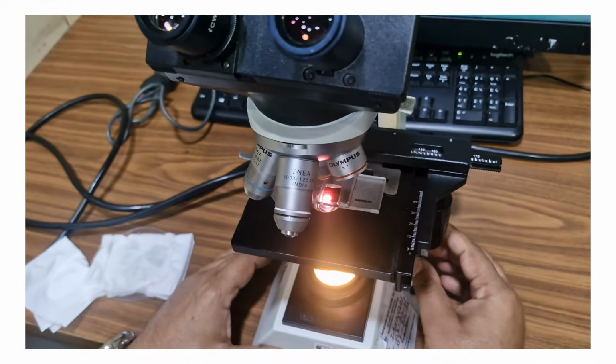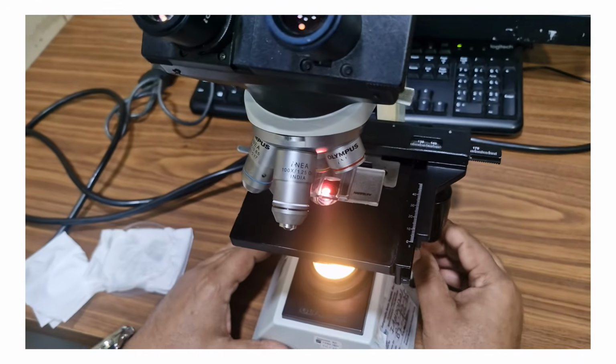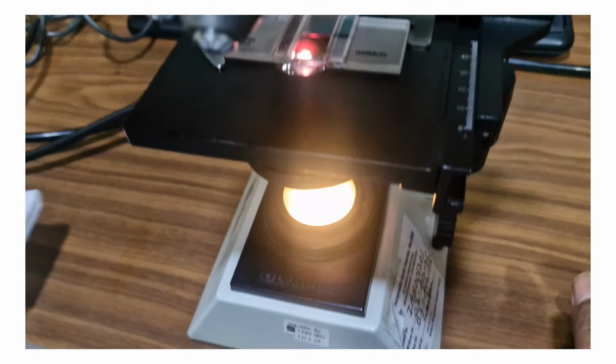Place the Nageotte's chamber on the microscope and using a 10x objective, count the white cells present in the entire 50 microliter volume of the counting chamber. White cells appear as intact cells that are refractile with a blue-gray color.